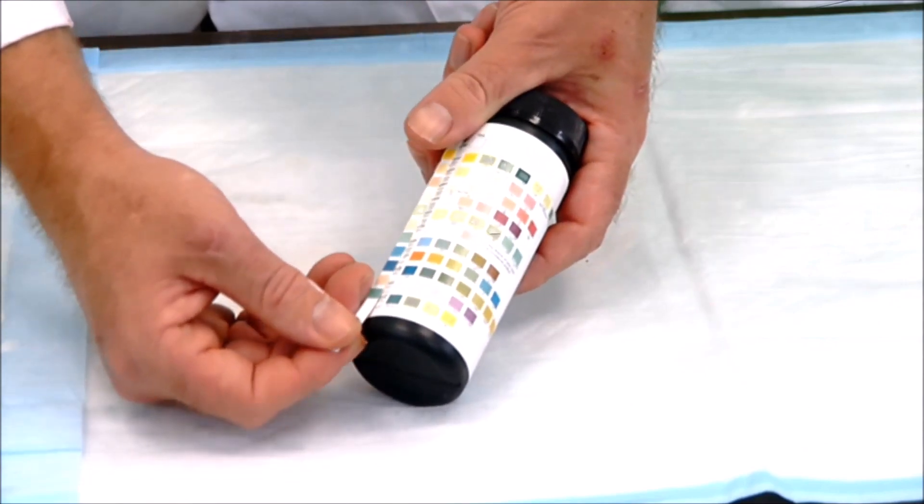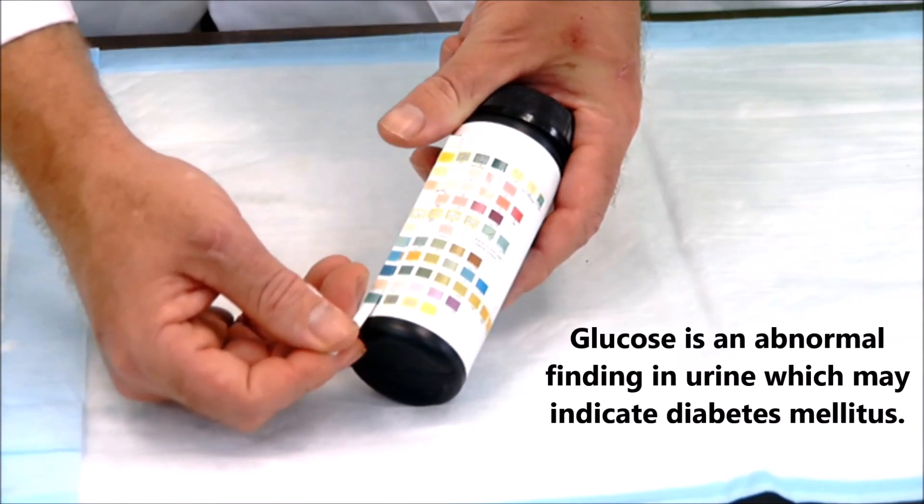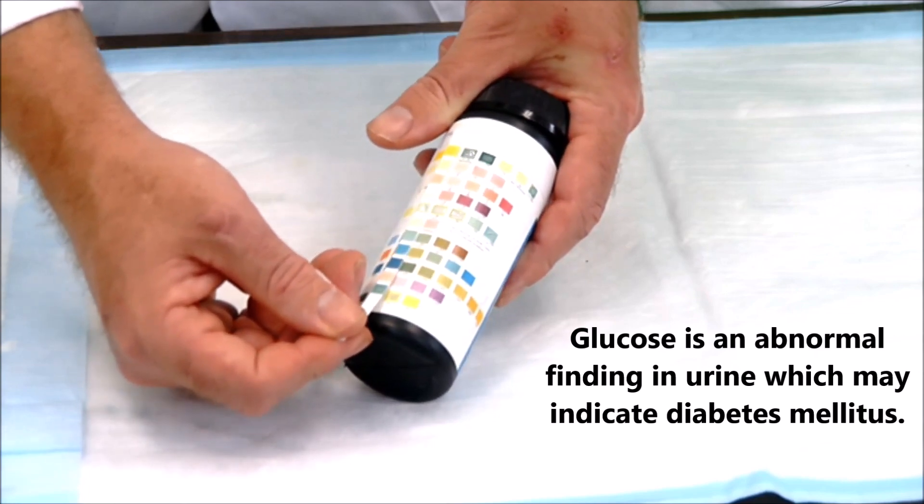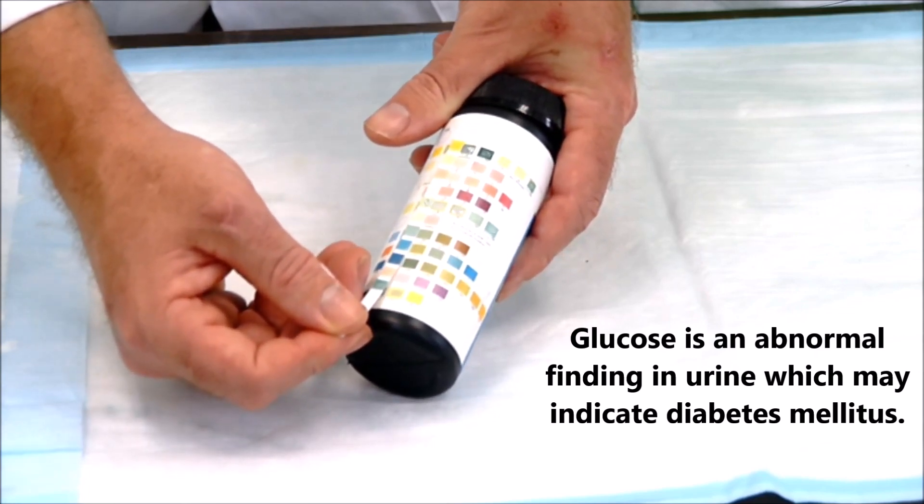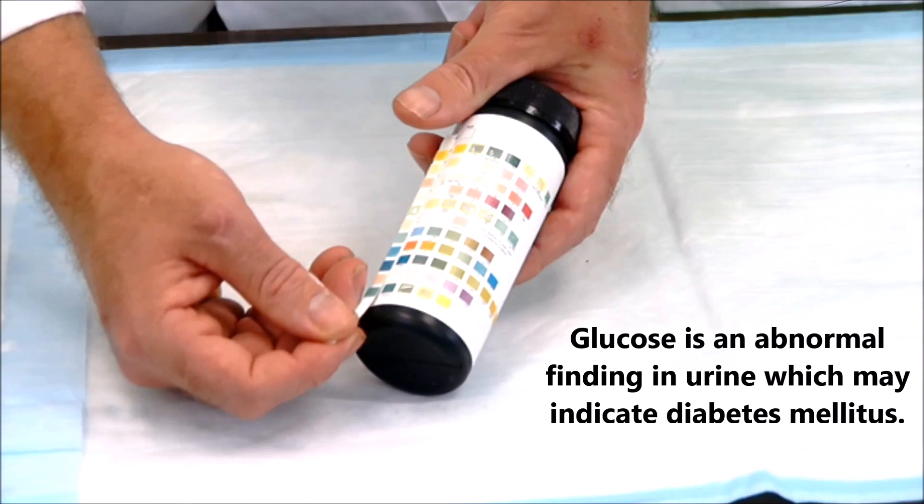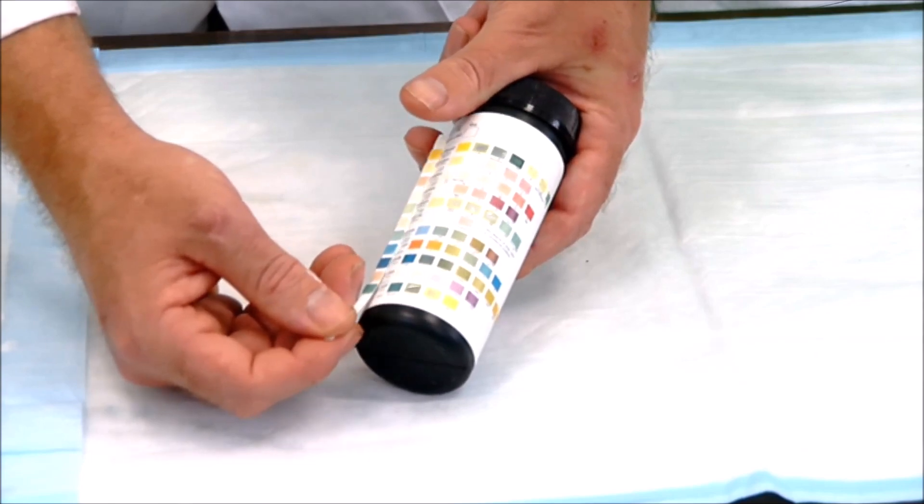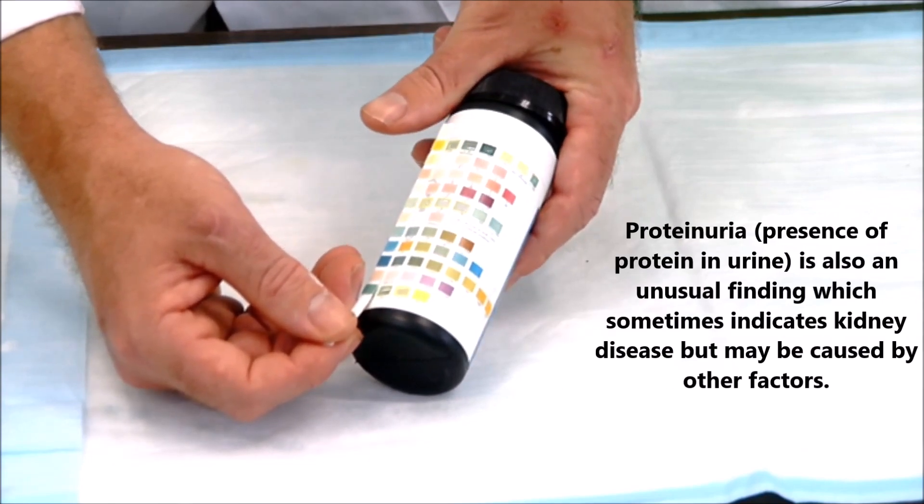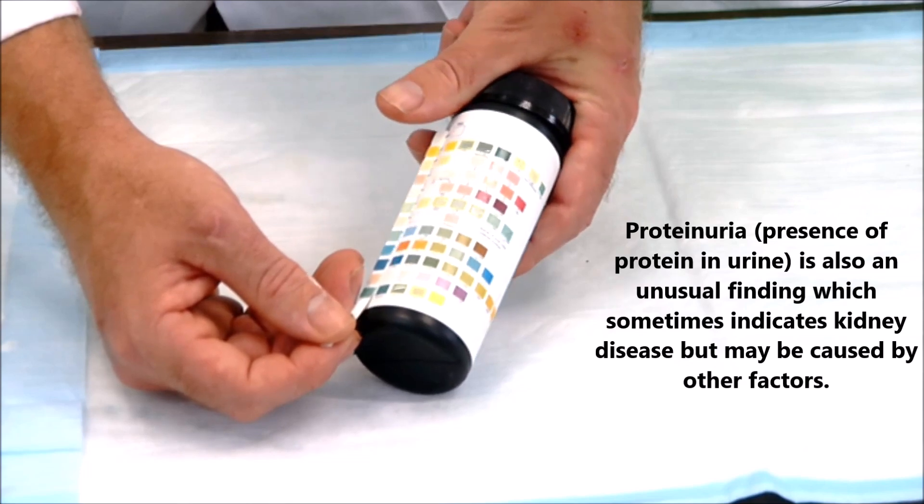Okay, next I want to look for my glucose strip. It seems like this strip actually does show a positive test for glucose, so that would be abnormal as well. Okay, and then next up here, I'm looking at protein. Protein does match up with a trace of protein. That would be unusual.